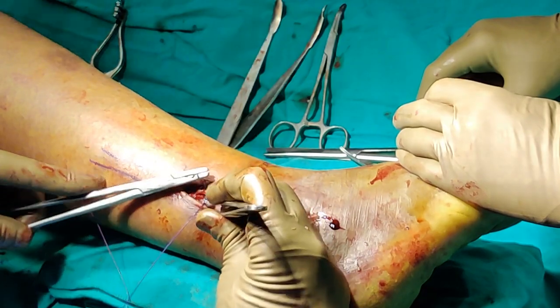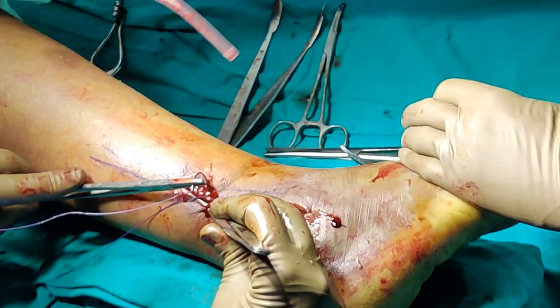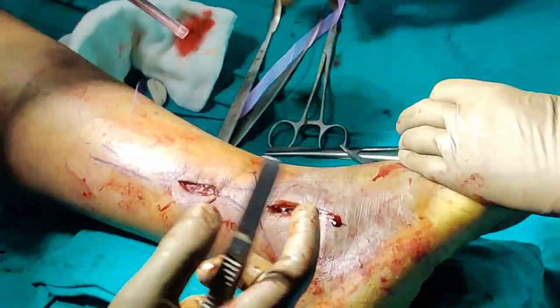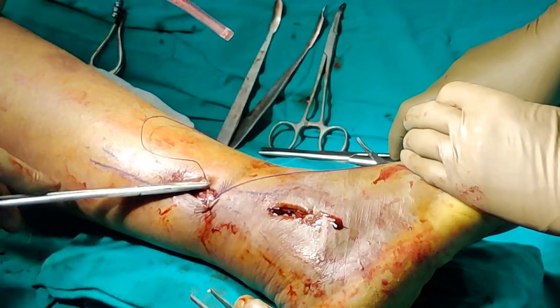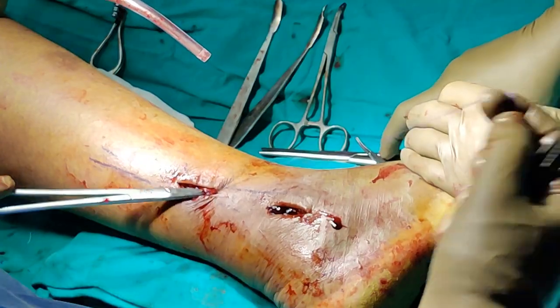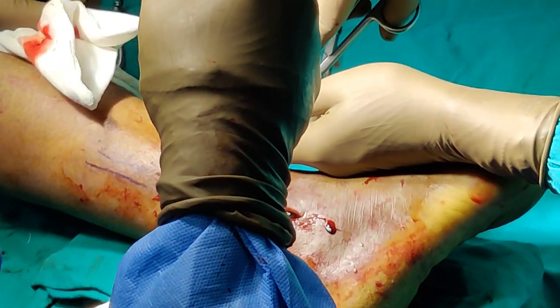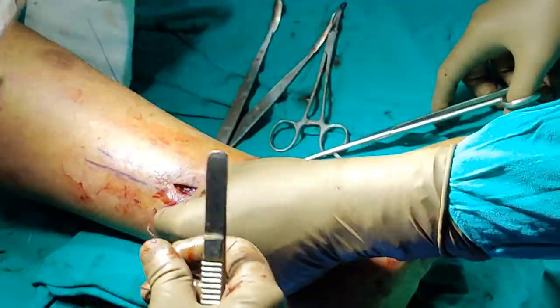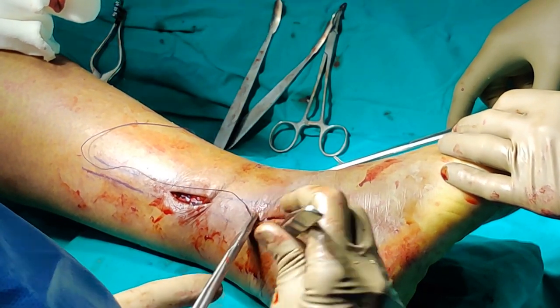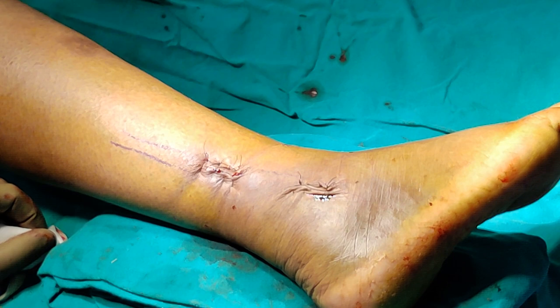I am going to close routinely — the next layer will be the dermis and then non-absorbable skin sutures. As I say in most of my operations, the most important part is closure. Be meticulous — make sure your plate is not exposed. If you do a good closure your good operation will remain good; otherwise oozing and infection can be heartbreaking if a well-done operation fails due to a bad closure. So be very meticulous when closing. We have used sutures at both incisions, some sterile dressing, and that is the end of the operation.